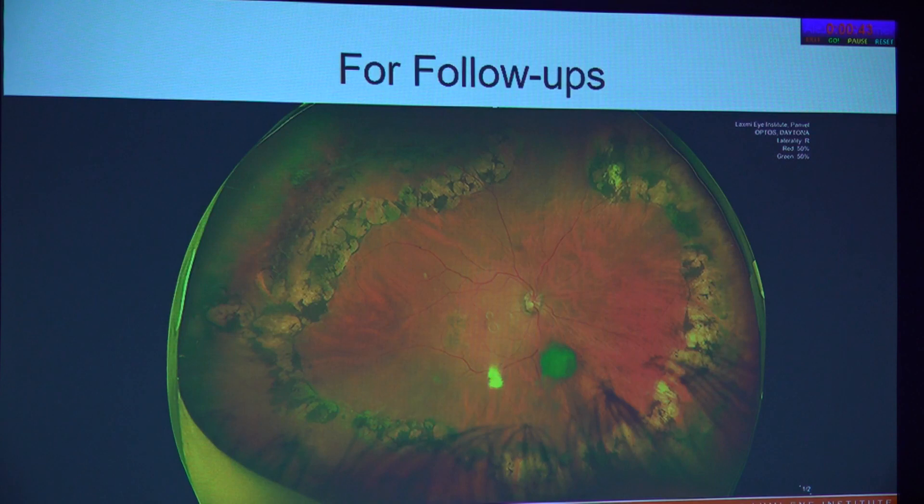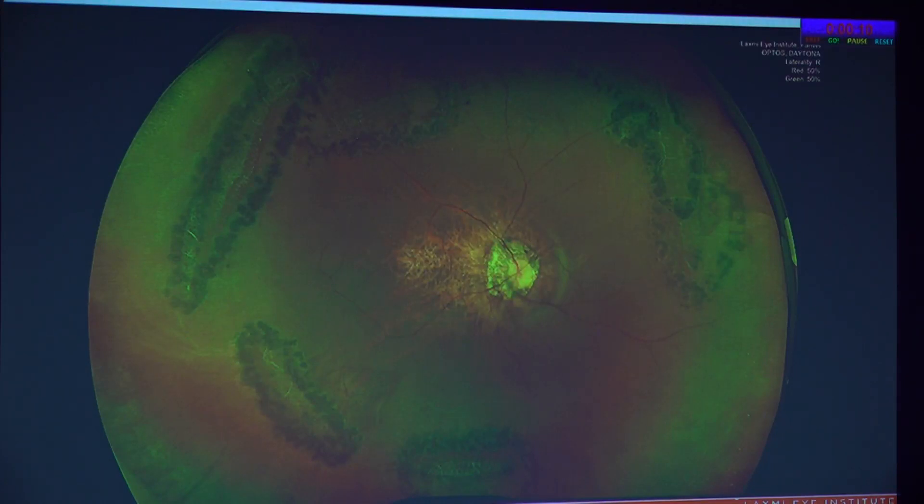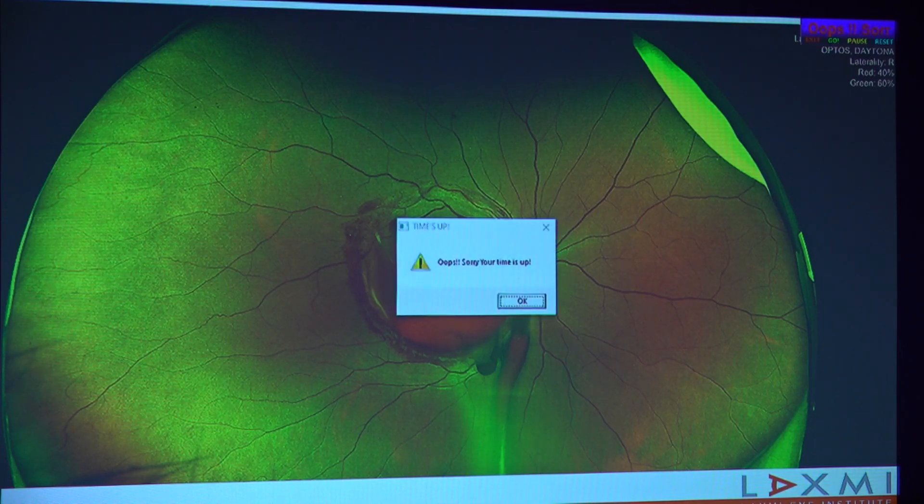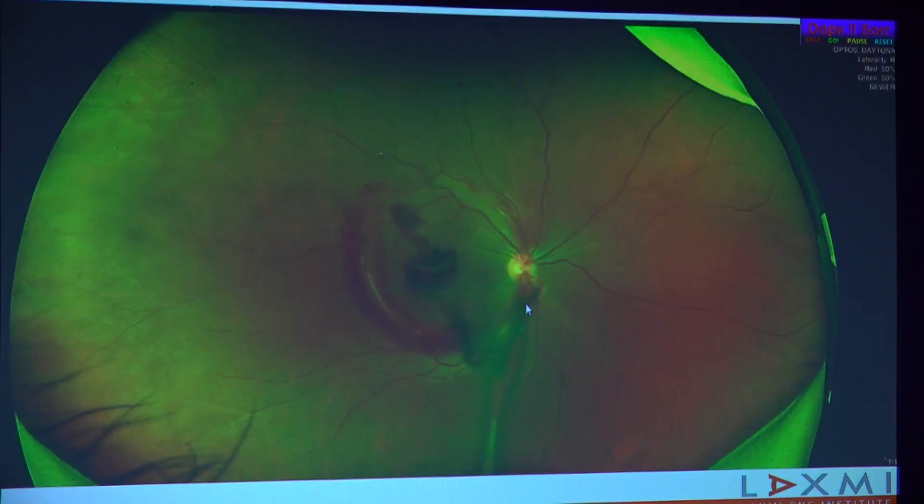Following up certain specific patients is a great application of this technology. This is a patient with a 2 mm pupil with ankylosing spondylitis — a one-eyed patient who has had extensive laser barrage done in the past. Waiting for him to dilate in OPD for an hour by putting multiple applications of tropicamide drops wastes a lot of time. Whereas in one undilated image, you can see how well the laser has been done and that he does not require any further treatment. Similarly, another high myope whose lattices have been nicely barraged is very reassured whenever he sees these images that he has no fresh lesions. And some follow-up studies show how lesions can improve over time, with drainage of blood with or without intervention.